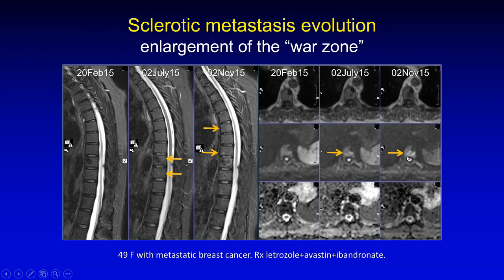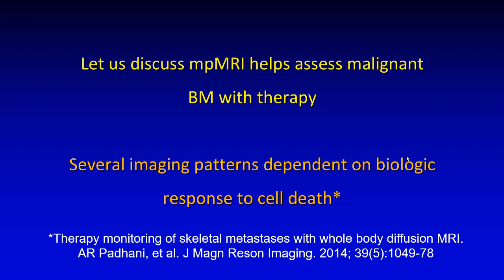Now, if you look at this very carefully, you will see this in your practice. This is just breast cancer. All of us have tons of breast cancer patients. You look carefully, you'll see it and understand what's happening. So I've said there are 7 patterns. I've shown you 3. Okay? But the biology is there. You should be able to sort out the others. And if you've taken that picture, it'll become very clear where these fall.